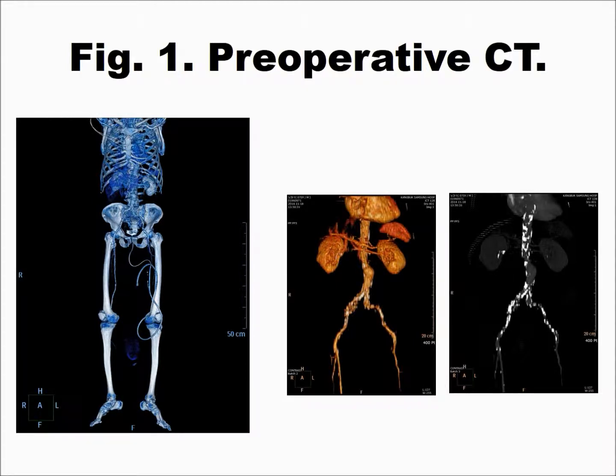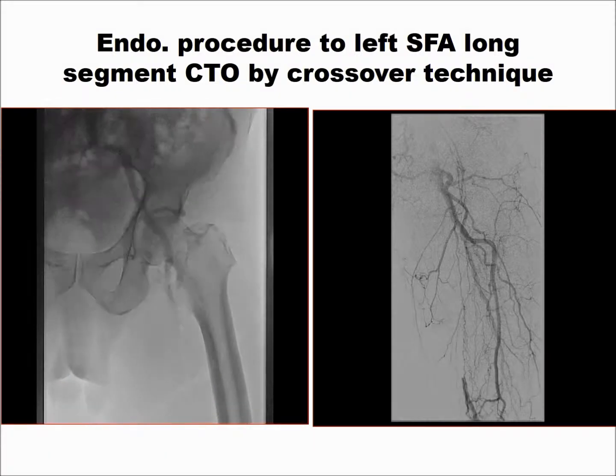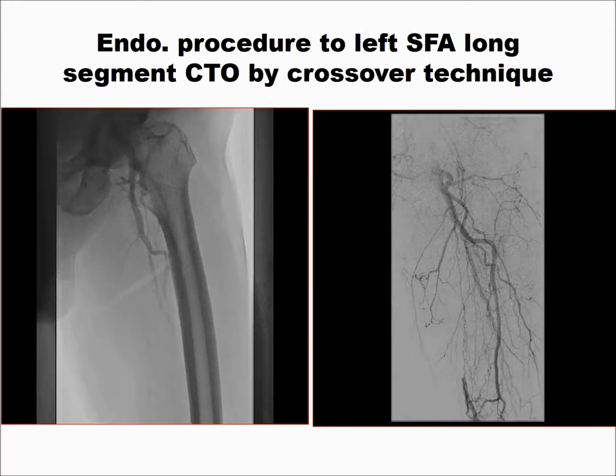This is the preoperative CT angiogram. The CT showed a long segment chronic total occlusion in the left SFA. This is an angiogram performed by another doctor.